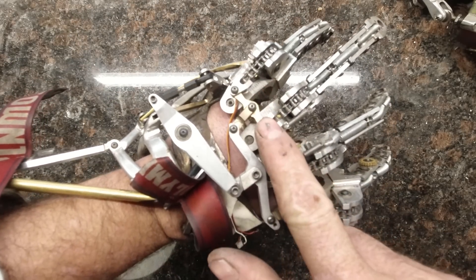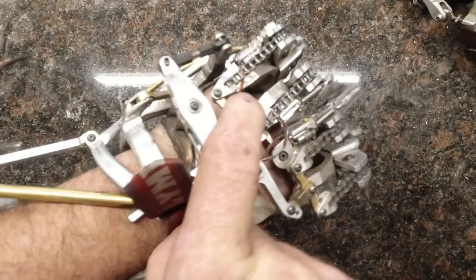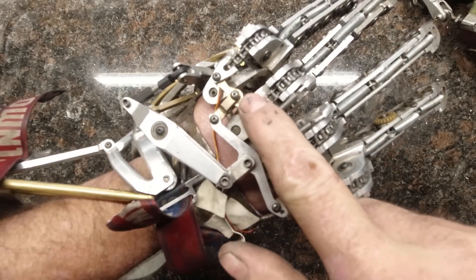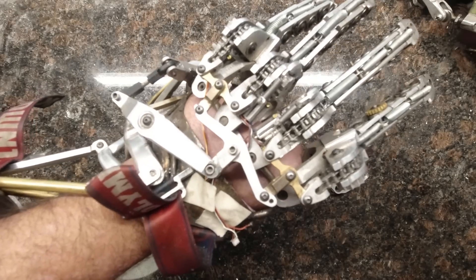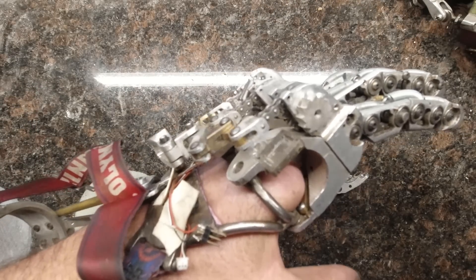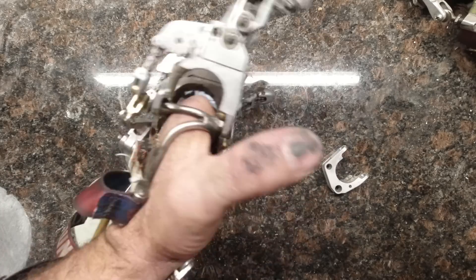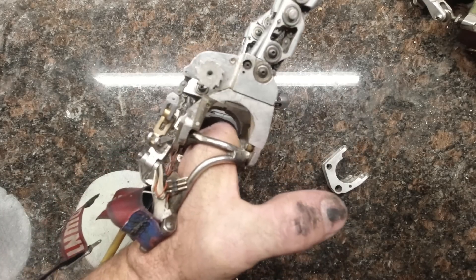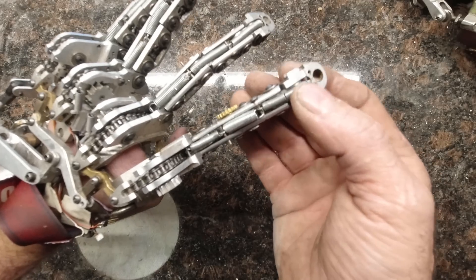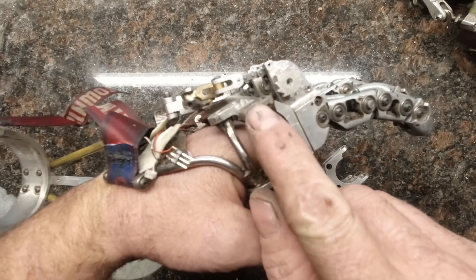Something else I'm looking at changing: currently the fingers are linked together one-and-two and three-and-four. The problem is, if I lock the ring and pinky, I think I'm potentially losing out on a pile of mechanical advantage that I could have if I linked them one-and-three and two-and-four instead. It adds a bit of complexity, but I'm willing to give it a try. The fingers themselves I've been very happy with — all of the lengths and travels work out well, so no changes there, other than maybe finally adding the magnets and fingernails.